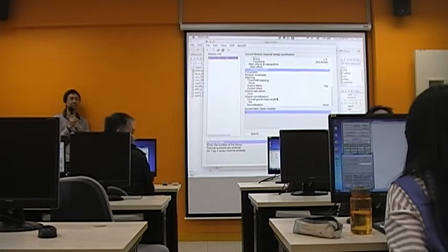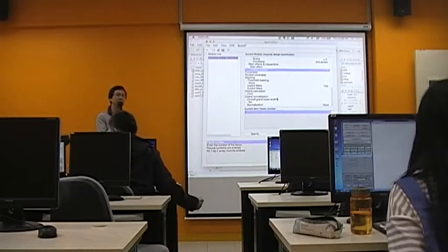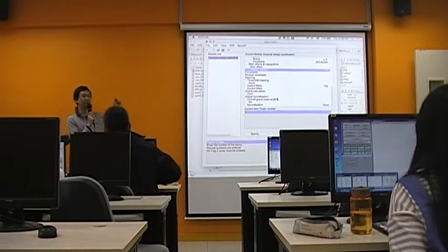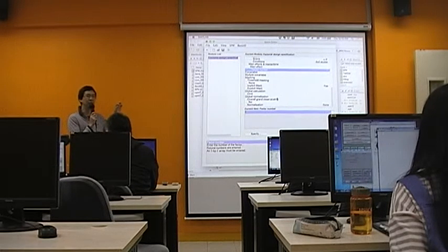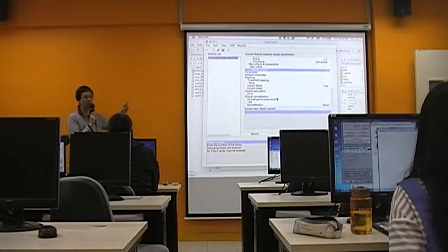I have a question for the scans, the input of the scans. Yep. So is it the raw image of the scan of each subject? Not the raw, but the results from the first level analysis. Oh, okay. So it should be the beta image or the contrast image. Okay. So for example, we have the contrast image.